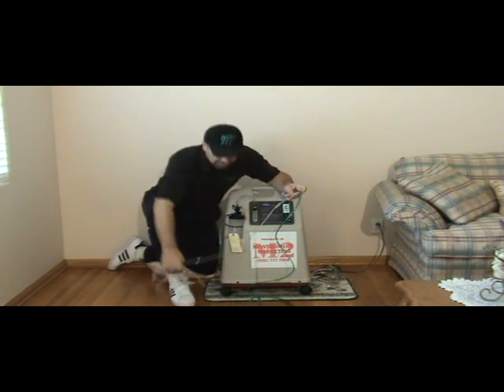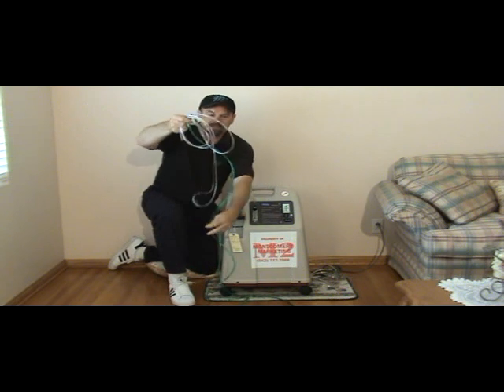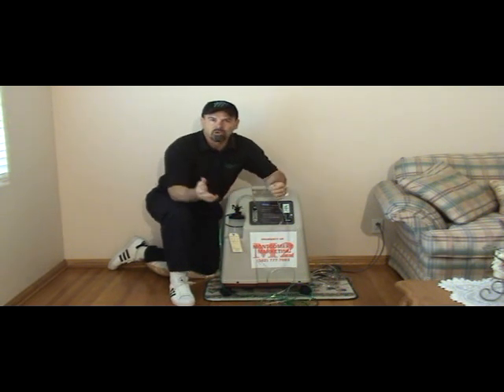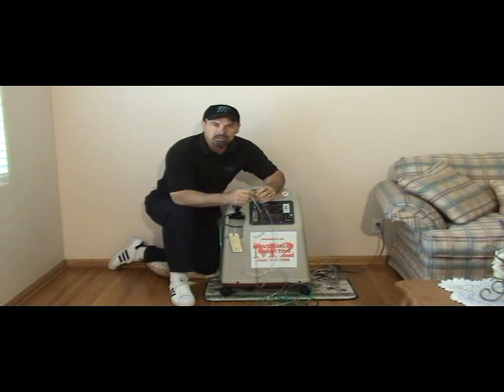And in this way, now as you can see, your patient is able to put the nasal cannula on and walk around the room or go to the restroom if they need to do that, or maintain a little bit more of the dignity that we're trying to do here for our patients.